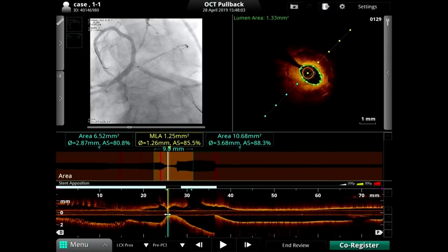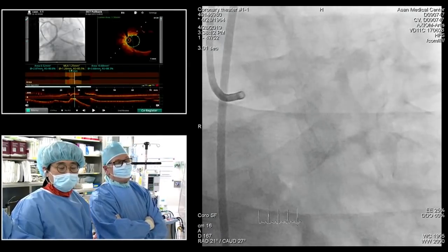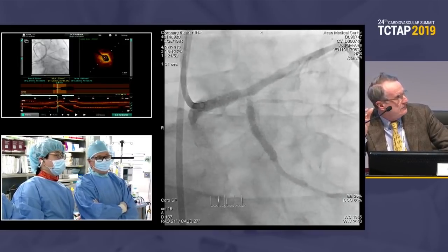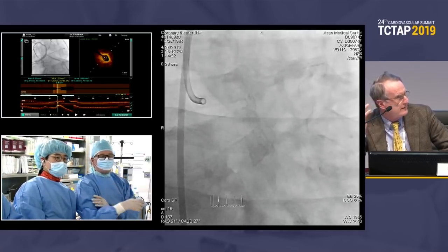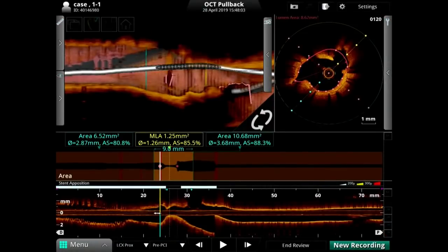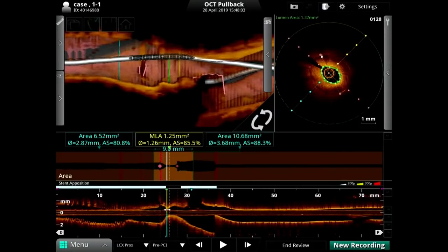You know, Thierry, it is almost always due to hyperplasia. We always try to expand the stent at the ostium of the circumflex very well, because we know, I think, it's due to the fact that the shear stress is abnormal. Absolutely agree. It's a physiologic problem. Can you show the 3D reconstruction? I fully agree with you, Antonio. I think it's because the carina is not in the center, so we have low shear stress at the level of the circumflex, and it promotes atherosclerosis.